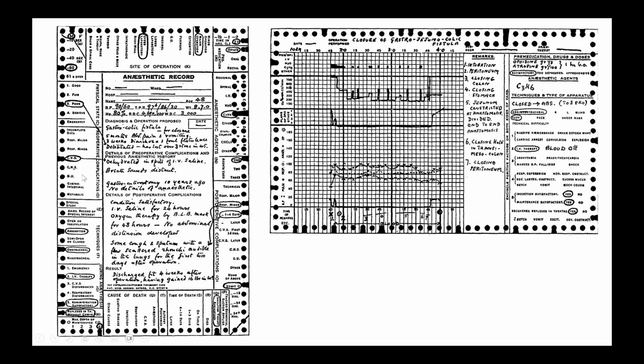Single paper measurements reading document. See, it is even here. What is this written here? Sir, anesthesia. Anesthesia record. Okay. Does it have any name of the person who invented or who popularized this? This is called the Noseworthy anesthesia record card. It is not a simple paper. It is a thick, yellow card. So it is called the anesthesia record card, and it had both sides.